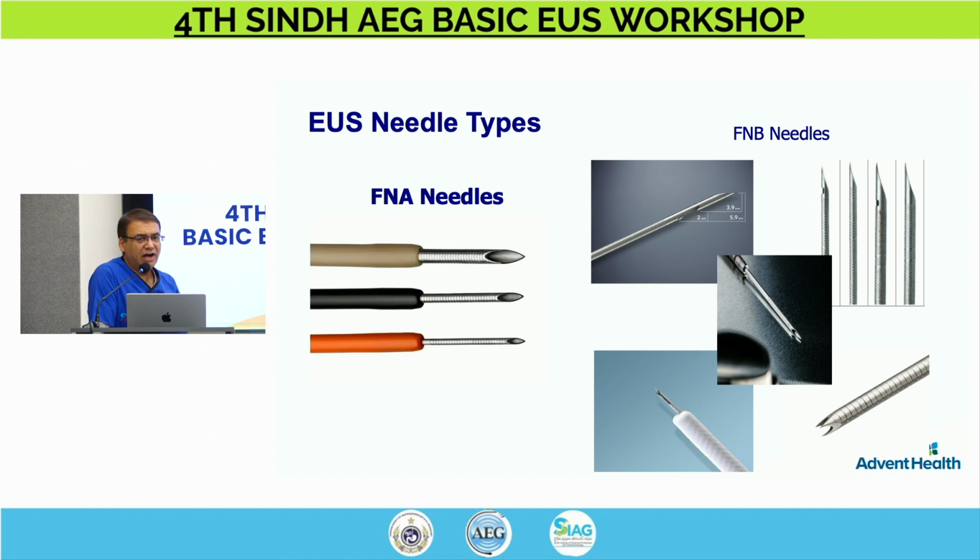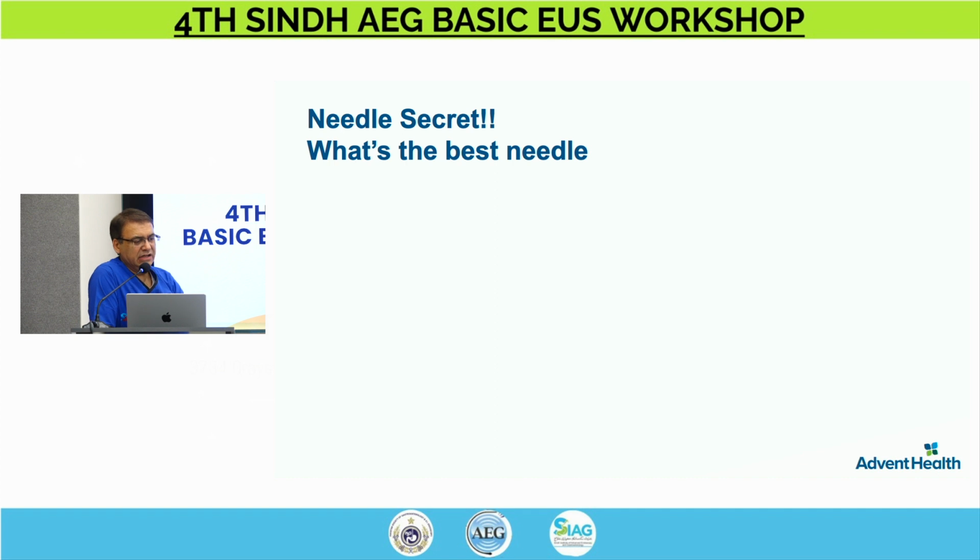Needles. How many needles are in the market? Like every company makes a needle, pretty much. And it becomes difficult to choose one, and a lot of it depends really on available resources, what is available to you. So all these needles, what I would say, what is the needle secret? I won't say that all needles are equal or they perform equal, but you can find any needle, you can find a way to use it and make it perform better.